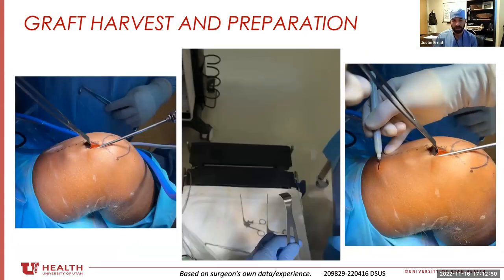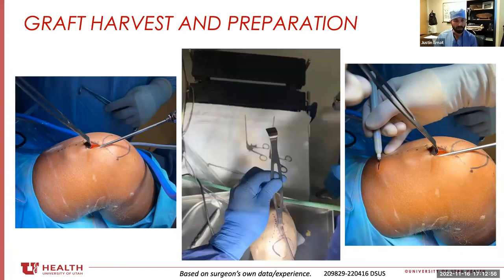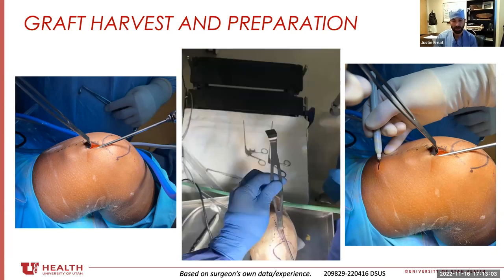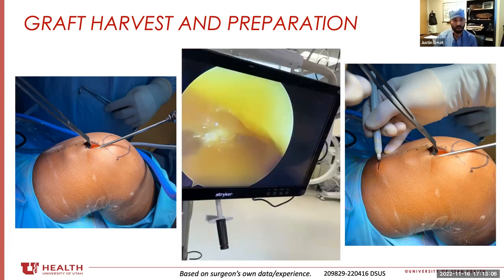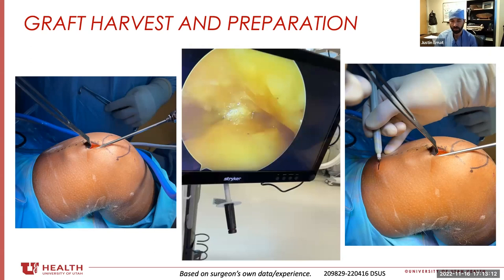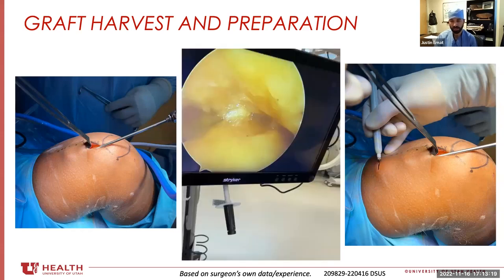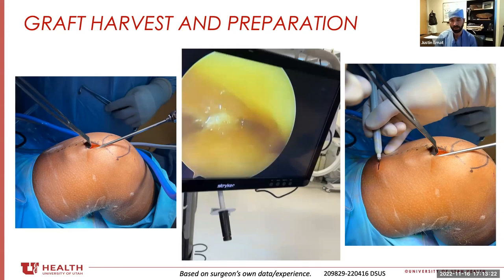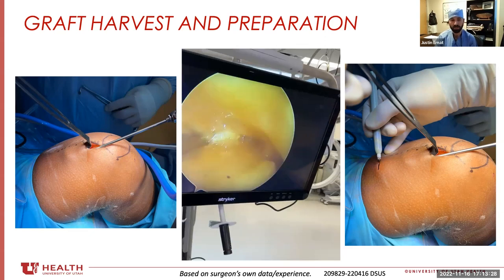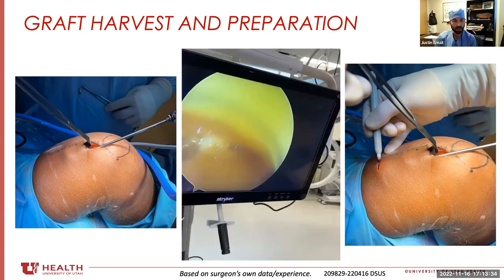After I've got that all elevated, I'll stick my arthroscopy camera up through the wound to identify the trajectory of the quad, make sure I've gotten it appropriately elevated, and make sure I'm not violating any of the quad muscle belly. I stick it all the way up and tent the skin with the camera so I can see the light. I mark the proximal-most extent, then pinch the camera at the superior pole and pull it out, and now I can measure the length of my quad tendon — you want at least about 65 to 70 millimeters of tendon for an adequate reconstruction.